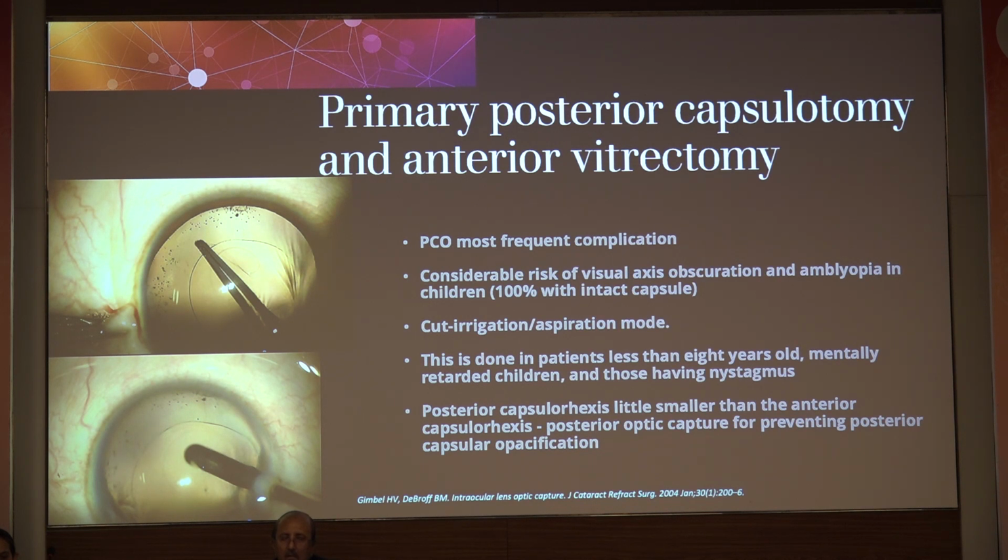So in posterior optic capture, the optic will be behind the posterior capsular rhexis, and the haptics will be between the anterior and the posterior capsular rhexis. So the optic will be behind and the haptics will be in between, in the bag.